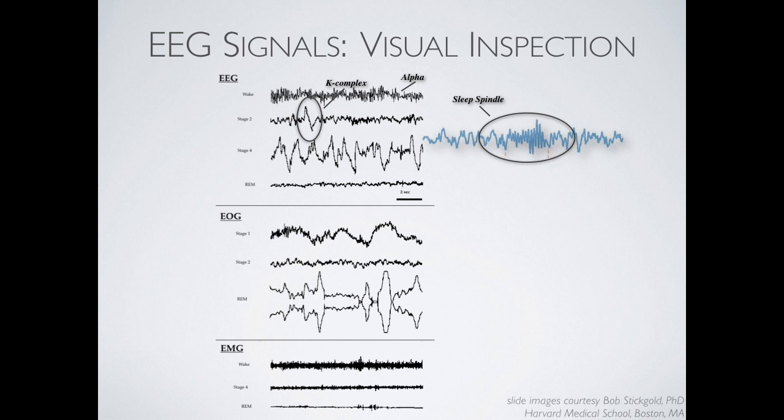And all of that's reflected in these sleep waveforms we see, K complexes, sleep spindles. If you're in a very, very deep stage of sleep, you see these distinct slow waves. In fact, this stage of sleep is often called slow wave sleep because of these very slow, large amplitude waveforms, about 1 to 4 cycles per second.